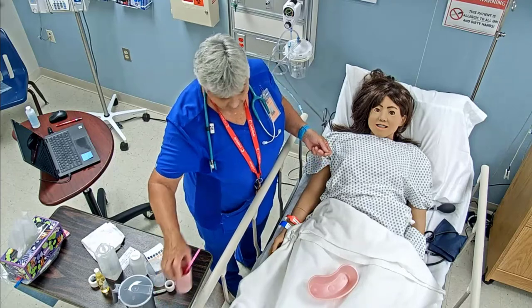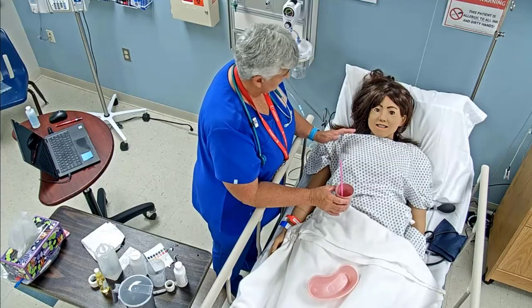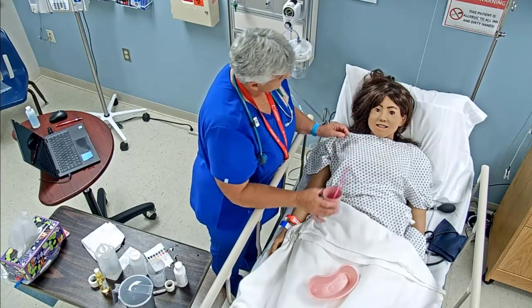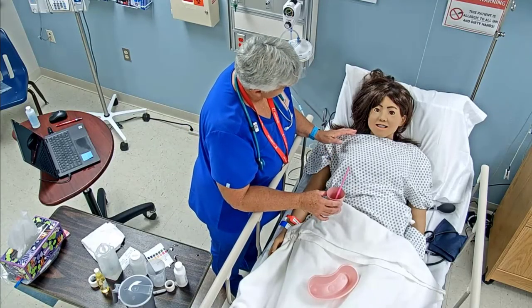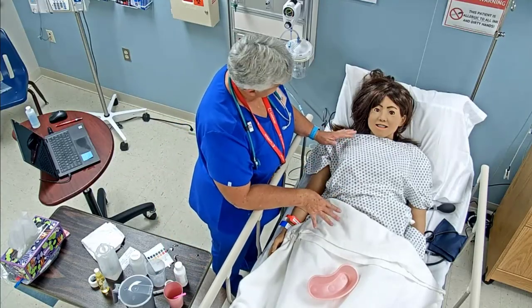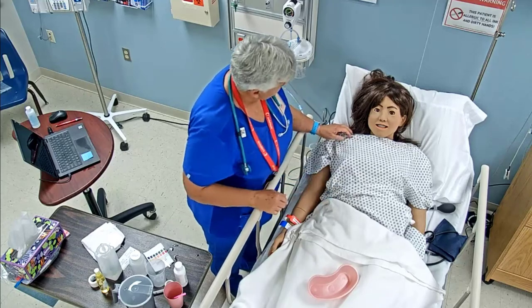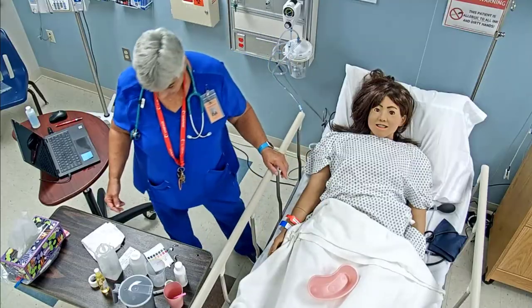And then I've got some cold water here. Now, if you're NPO, we won't be able to give you anything, but you were able to tolerate that. So we just want you to take a little sip, just a little cold water to help with the dryness in the back of your throat, okay? We don't want you to take much, just until we make sure that you're not going to get sick at your stomach or anything since we took that out. Are you feeling okay? I'm going to check your nose to make sure that there's not any bleeding or anything like that. You've got your Emesis basin there if you need it, and your tissues over there.